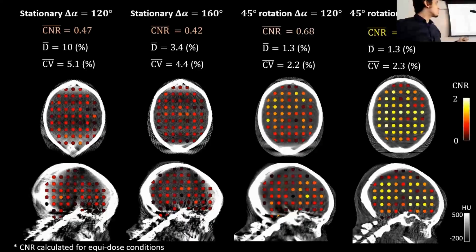But what we saw with this configuration is that, more or less, including the ones in the back, they are visible enough so far. We are still exploring other techniques to enhance the image quality of our design, to be able to increase these contrast to noise ratio values for the different lesions.